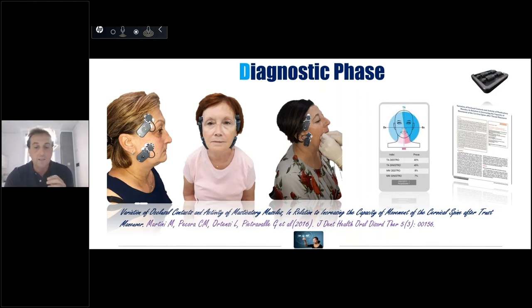The data that you can get is the same for the same patient during your activity. But the instrument can change the situation if you have an old woman or a young woman. So you can record the state of the patient. So during the first visit, for example, in these cases, I take this measure. And for me, the most important index is the impact index.